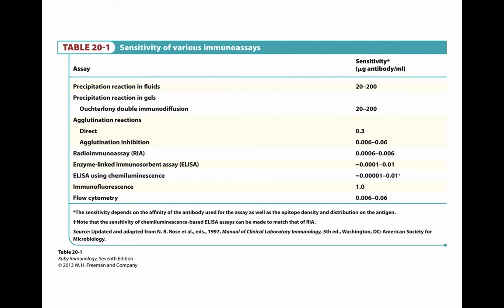Okay, I'm going to continue talking about some of the various immunoassays, but now I'm talking more about how they can be used and what you can do with them. So, first on the list is precipitation reactions in fluids.